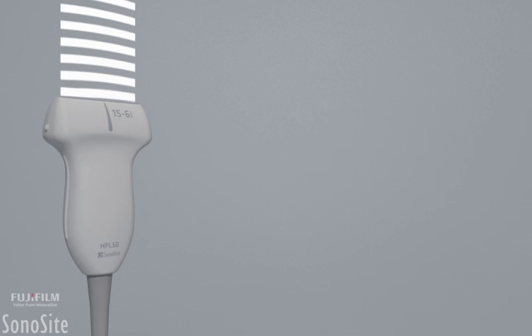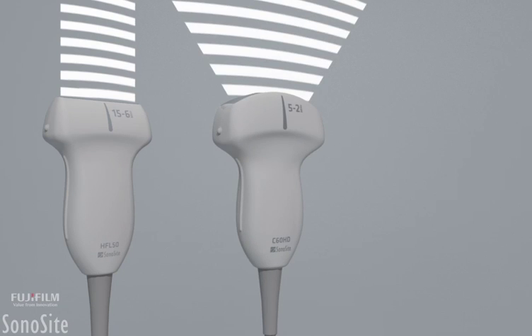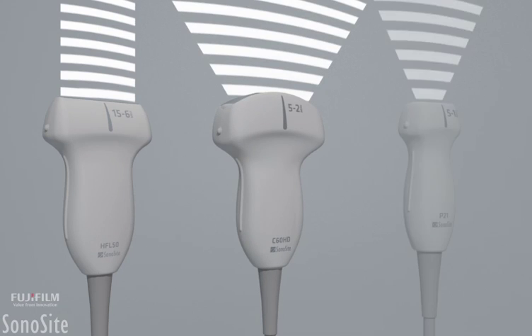A high-frequency linear array transducer with a lung exam type and a low-frequency curved array or phased array transducer with an abdominal setting is used for assessment of the pulmonary system. There are three specific areas of pulmonary ultrasound that are reviewed.